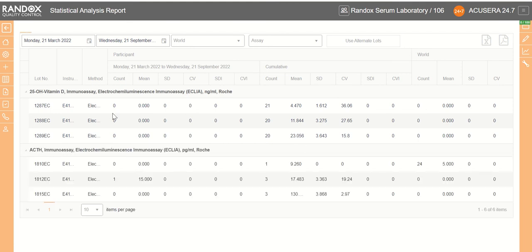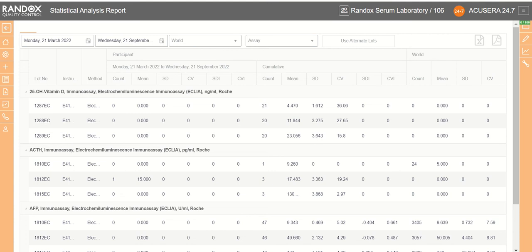As you see, our QC tests are being added and all the data that we have or has been entered. As it's being added, you'll notice an orange bar creeping across the screen. The more data you have, the longer this will take. The longer the data range, the longer it will take also. So now we'll look at what is available in terms of our data.